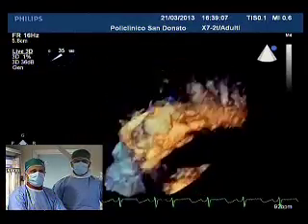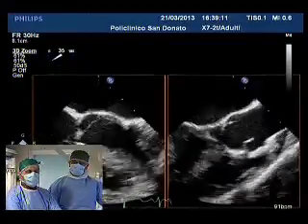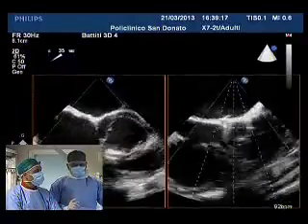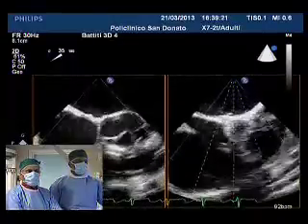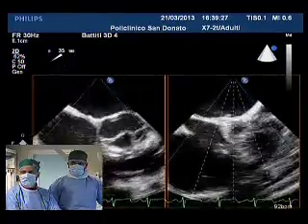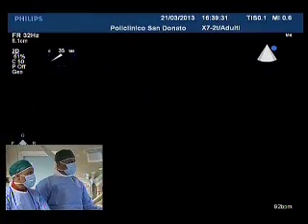That's right. But the ADO2 AS, I think Dietmar was thinking about the ADO2 AS, which is a very short device, 5 millimeters diameter. This could have been good. You could have tried it also. I don't have experience because I'm doing the new device, but it's also maybe a good alternative. It's a soft device. I think it's a good outcome for this patient.